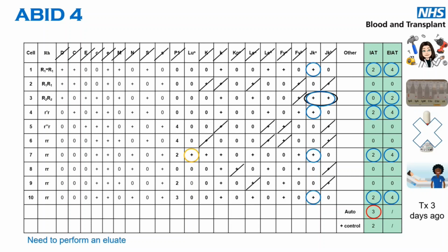An anti-JK anti-sera is IgM. So if they haven't been transfused and that's positive for IgG, I'm okay to use this reagent because it's not an IgG anti-sera, it's an IgM one. So that goes back to your knowledge of how anti-sera and antibodies work. You need the patient's history. They were transfused 3 days ago. So is anyone going to phenotype this patient?